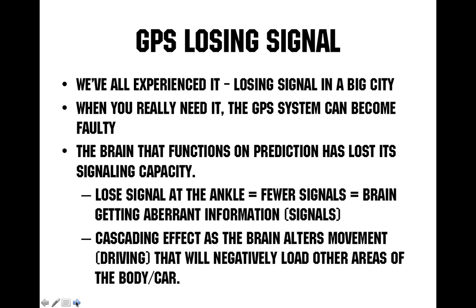Here's a really good idea. This is more of an analogy, but think about the global positioning system, the GPS, losing a signal. If you lose your GPS and you're driving, you really lack an idea of where you are. The analogy is that it's the same when somebody gets injured. We lack that awareness after an ankle sprain or a knee injury of where we really are in relation to space. So that tissue may not need tons of hard manual therapy to start. It may need more positioning sense, awareness, and tactile acuity via the RockBlade tool to give us more information to that area so we can move on to a motor control program.